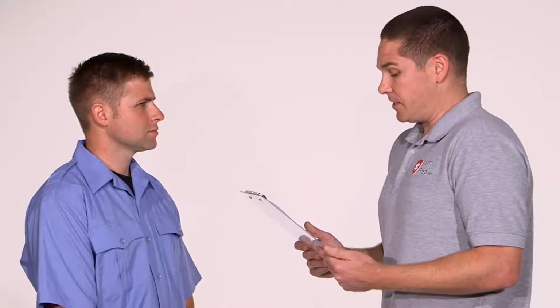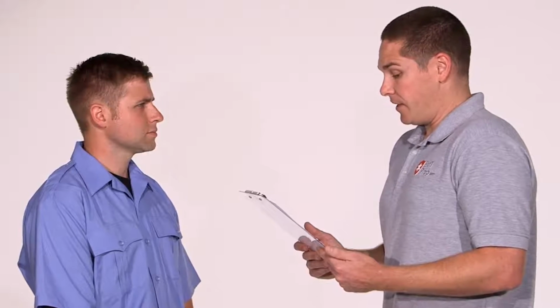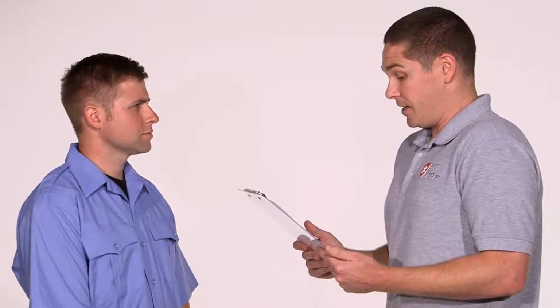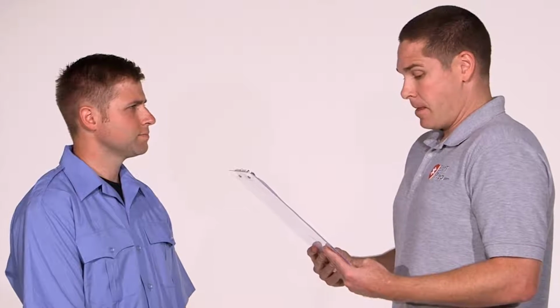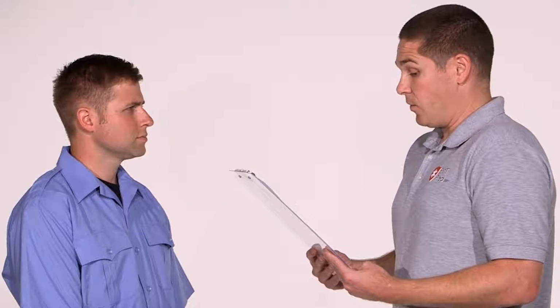You will have 3 attempts to successfully place the supraglottic airway device. You must actually ventilate the mannequin for at least 30 seconds with each adjunct and procedure utilized. I will serve as your trained assistant and will be interacting with you throughout these skills. I will correctly carry out your orders upon your direction. Do you have any questions? I do not.